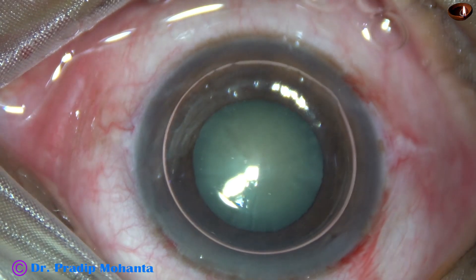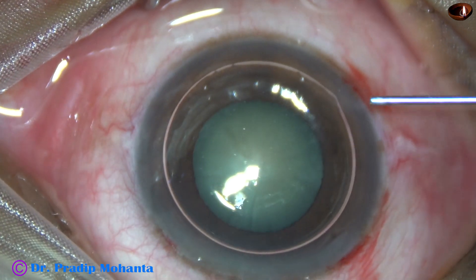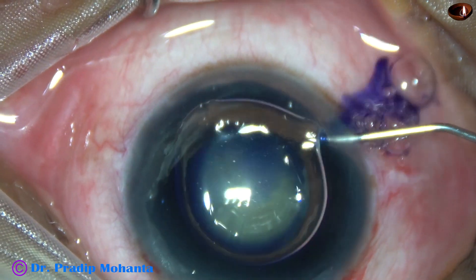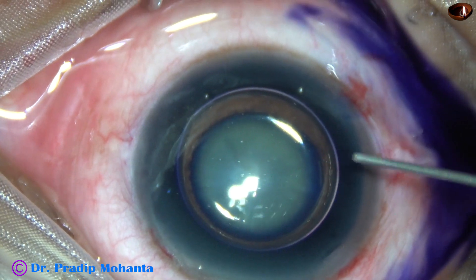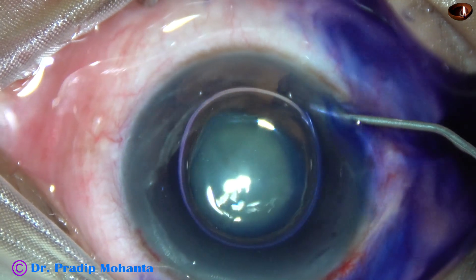An air bubble is injected to fill out the anterior chamber. Beneath this air bubble, trypan blue dye is applied over the anterior capsule. The dye should touch on all parts of the capsule.